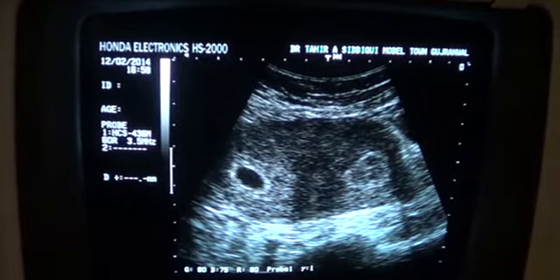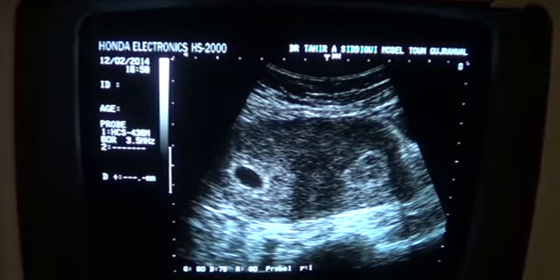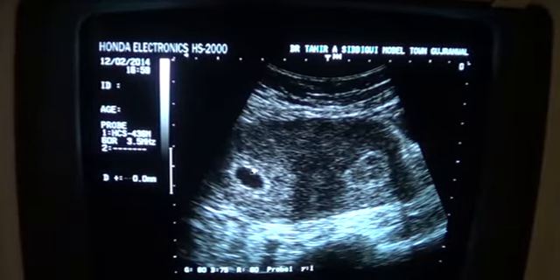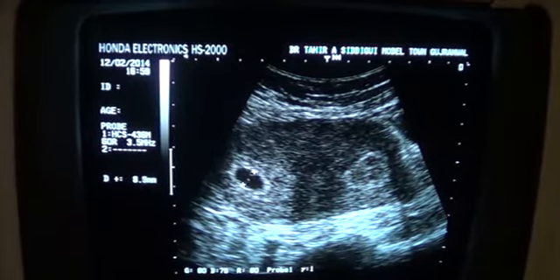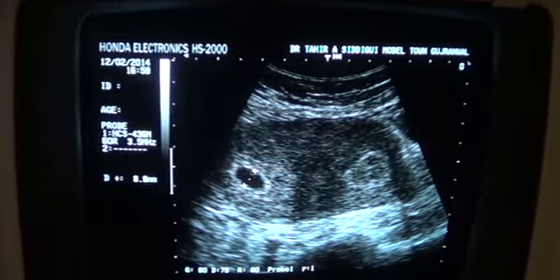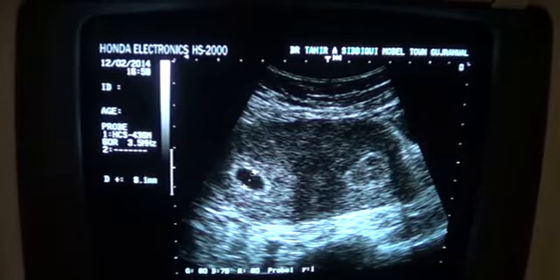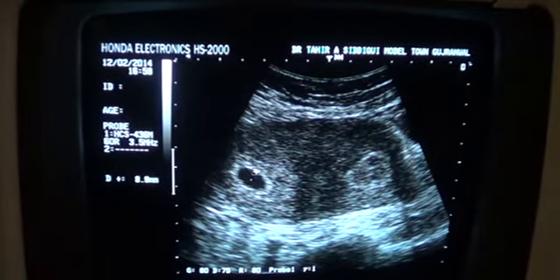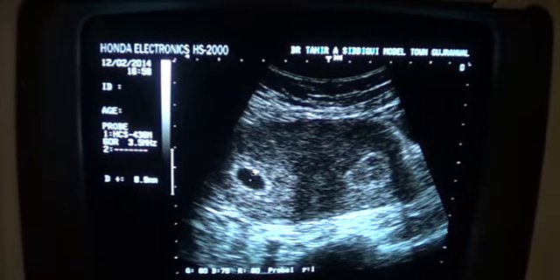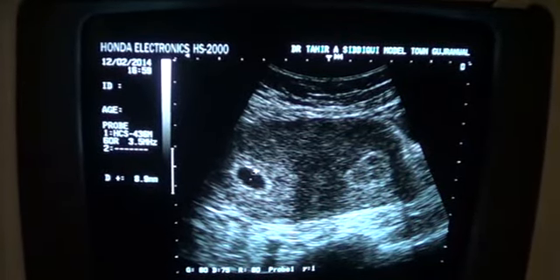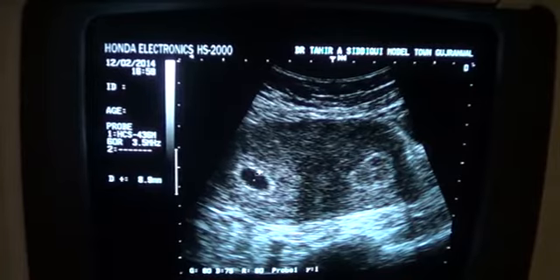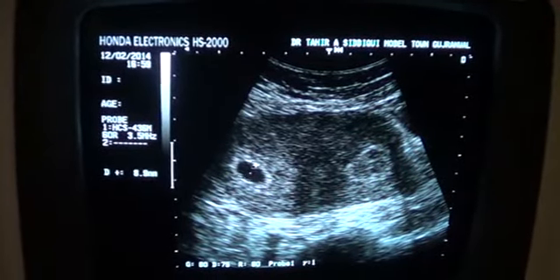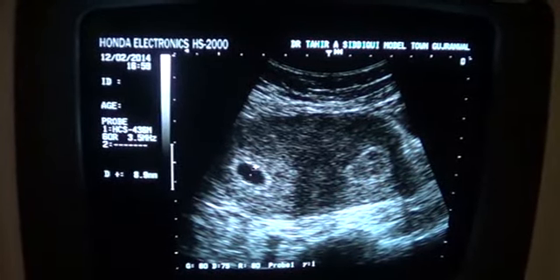This is the double decidual reaction around it, measuring 8.9 mm, or approximately 9 mm. So this is a case of very early pregnancy of 3 weeks.